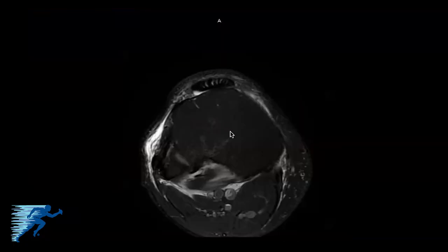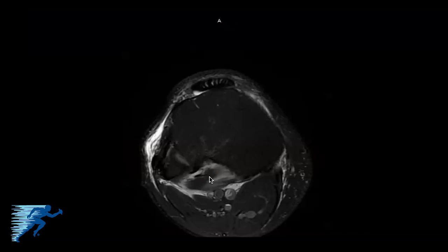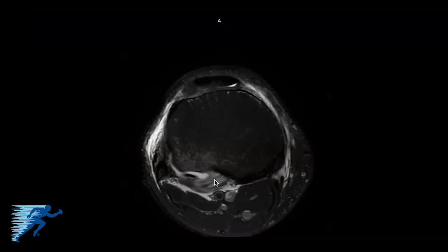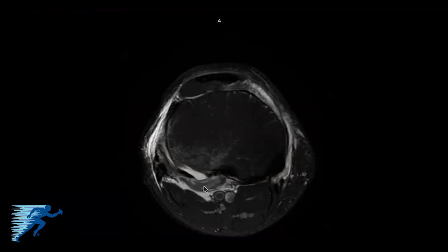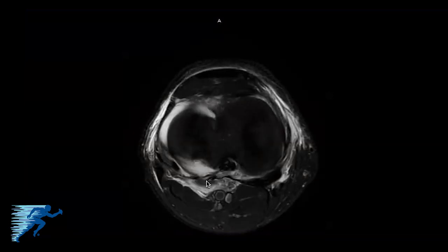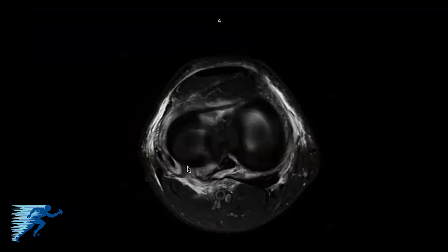The final thing we'll go through is the axial view. The axial view is not that good for looking at posterolateral corner structures other than the popliteus tendon. If we see swelling within the substance of the popliteus muscle on the tibia, we have to be more concerned there may be a popliteus disruption, either at the musculotendinous junction or torn off the femur. There's a little bit of swelling here but not a great deal. As we course more proximal to the level of the joint, we start to see the FCL in the substance.